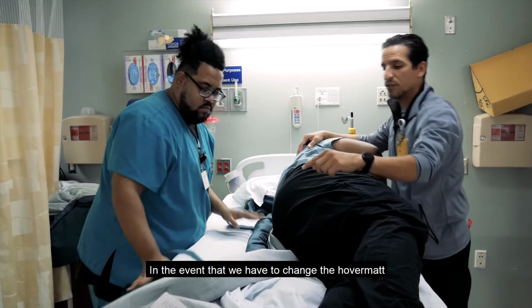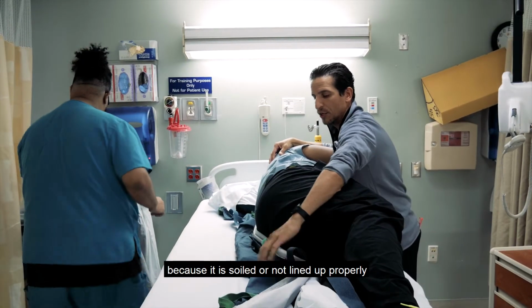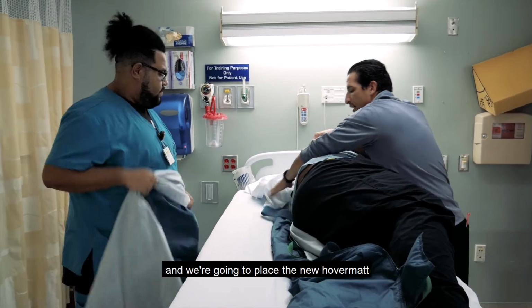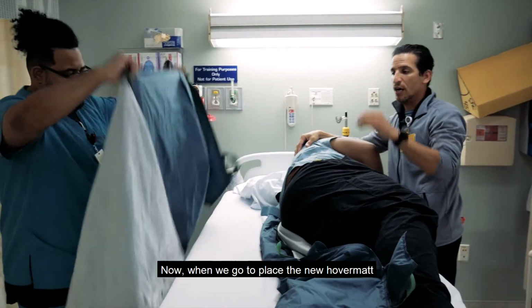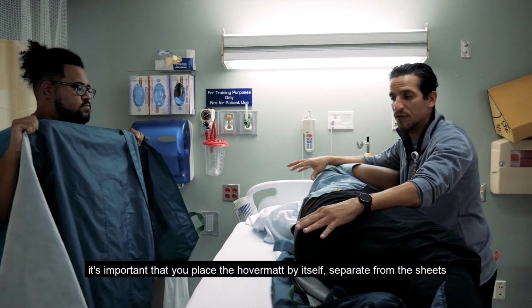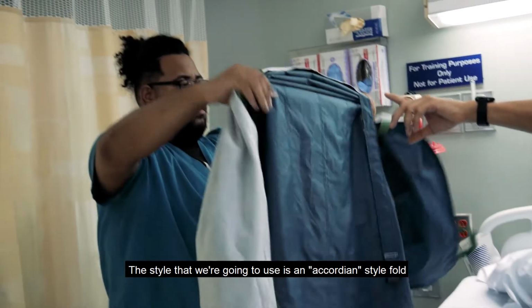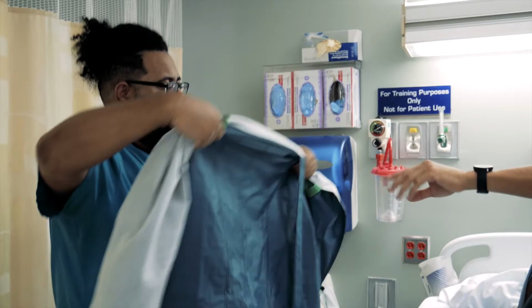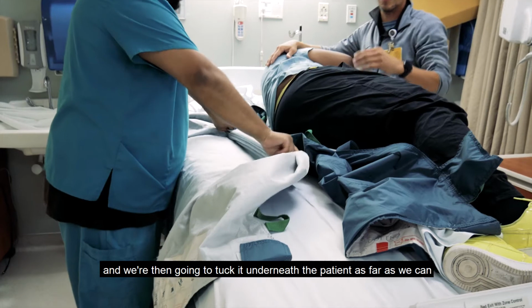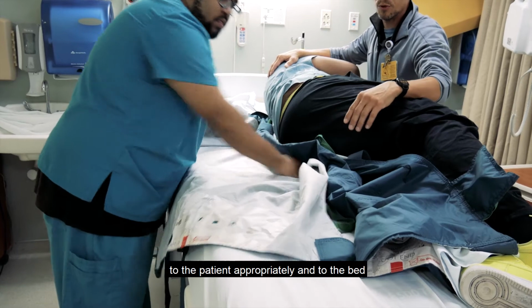In the event that we have to change the hover mat because it is soiled or not lined up properly, what we do is we fold up the old hover mat and then we're going to place the new hover mat. Now, when we go to place the new hover mat, it's important that you place the hover mat by itself, separate from the sheets. The style that we're going to use is an accordion style fold, okay? And then we're going to tuck it underneath the patient as far as we can, and of course we're going to make sure that the hover mat is lined up to the patient appropriately and to the bed.